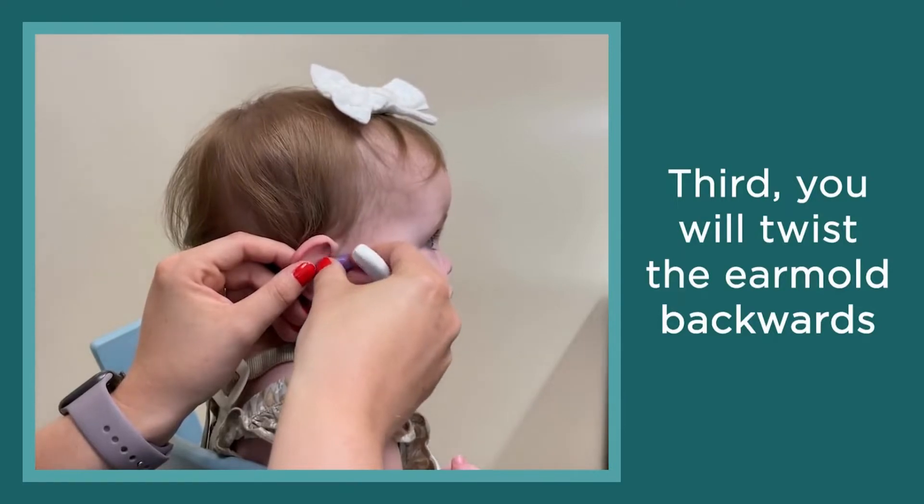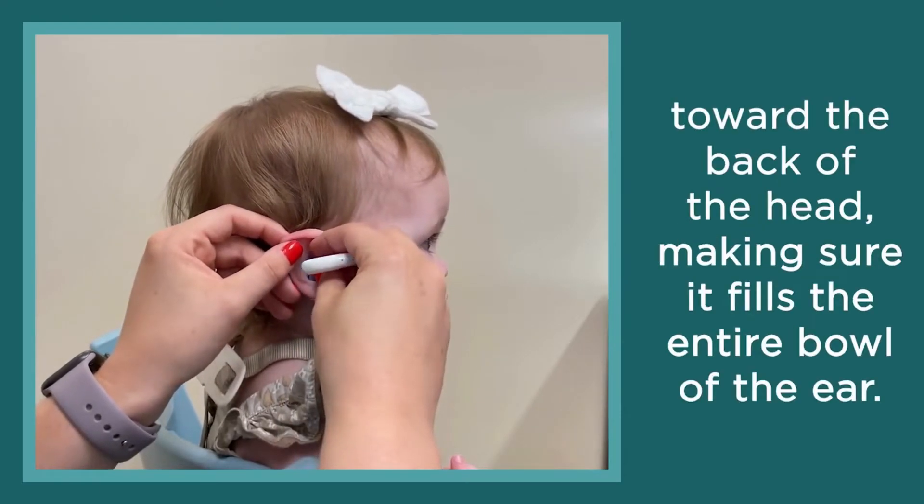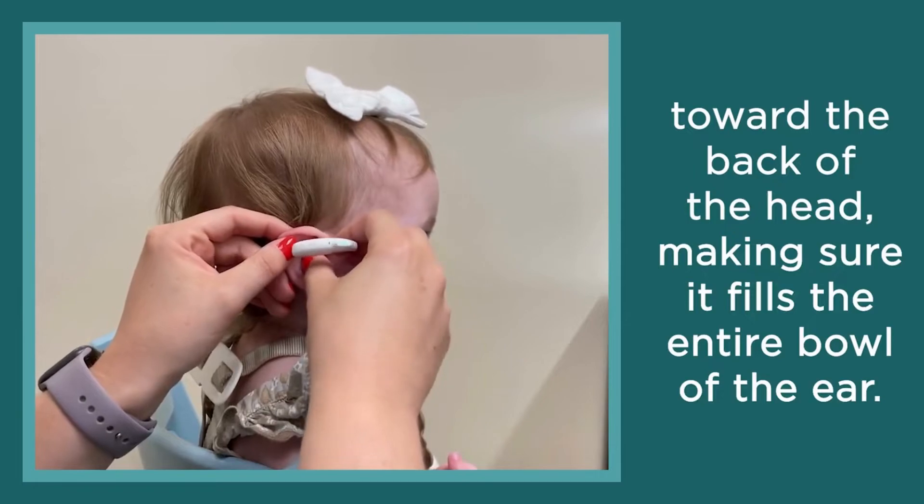Third, you will twist the ear mold backwards toward the back of the head, making sure it fills the entire bowl of the ear.